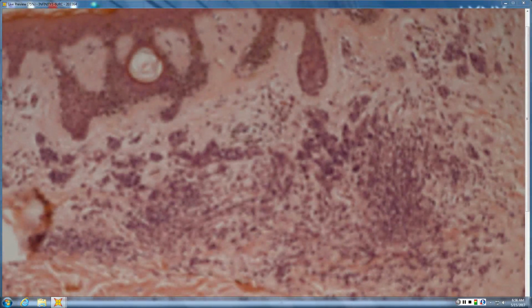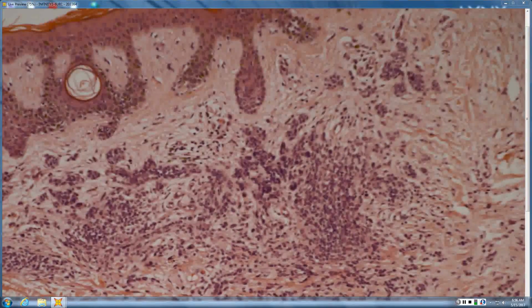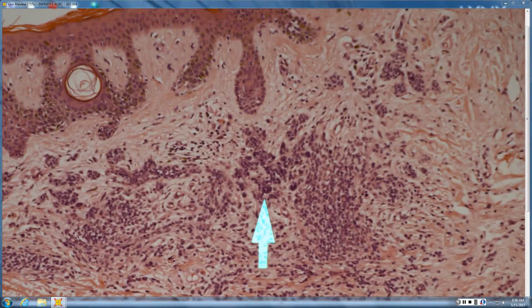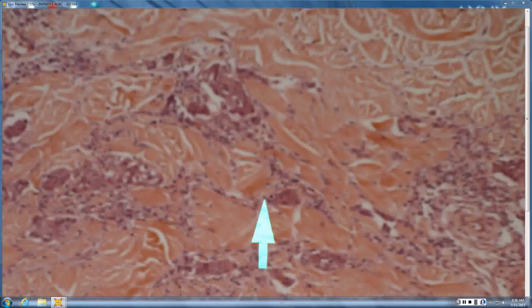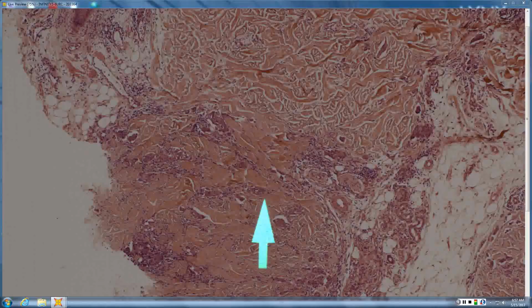But this is just a run-of-the-mill nevus. You can kind of see there again the nests and things. Intradermal nevus, maybe there's some compound, some stuff up there too. And it's probably been changing, but not because the nevus has been changing, but because below it there's metastatic cancer. And so this is more inflammatory breast cancer that was below it that was kind of harder to see from scan.